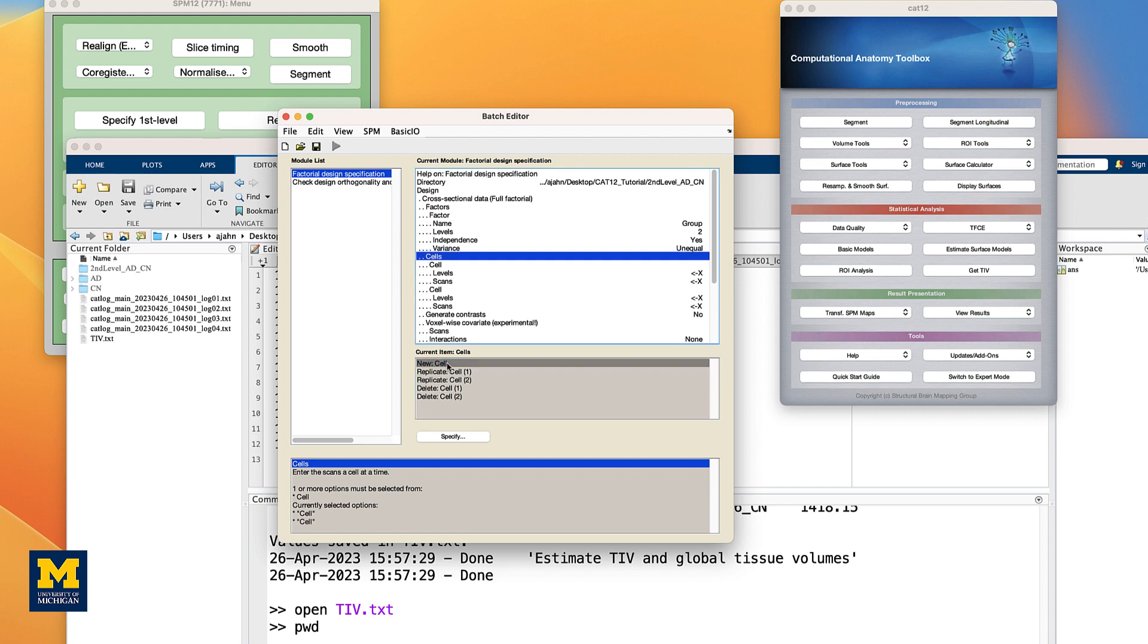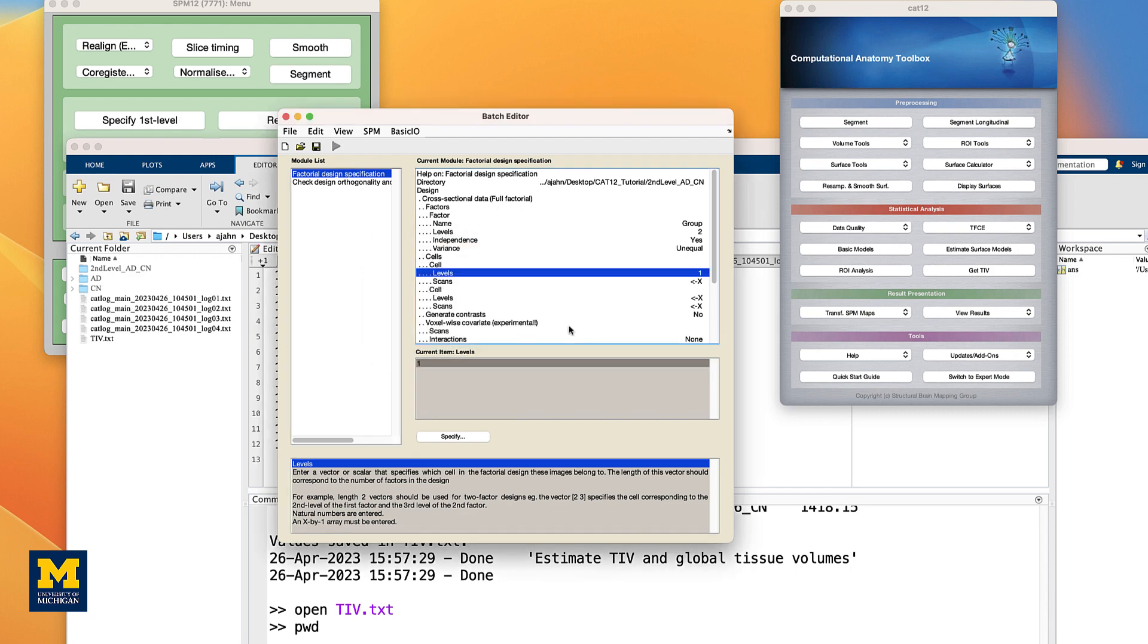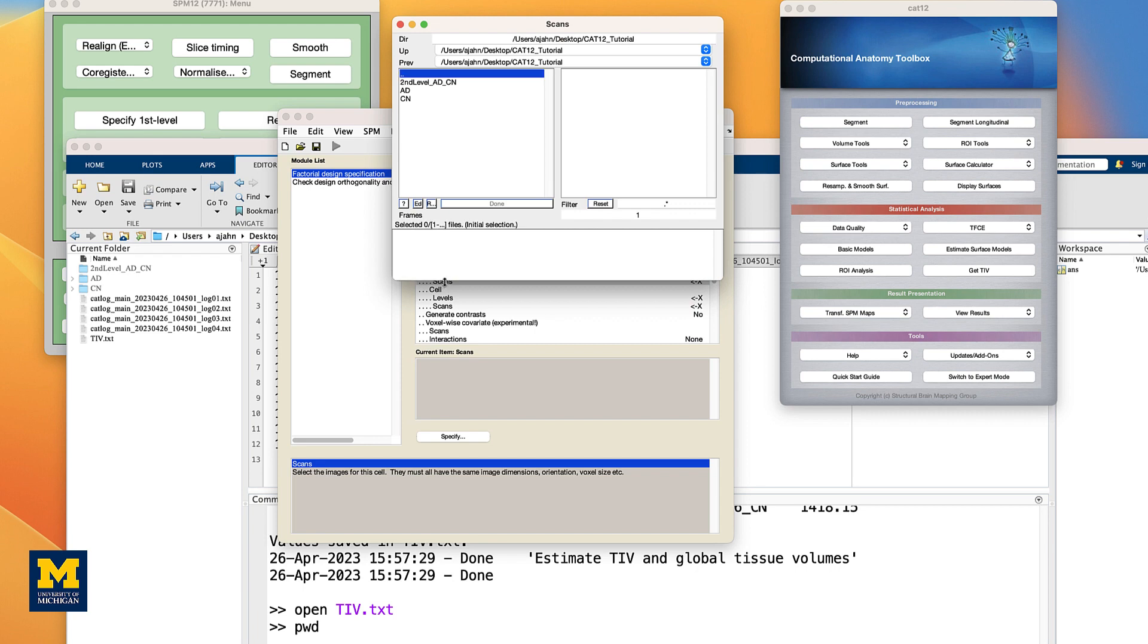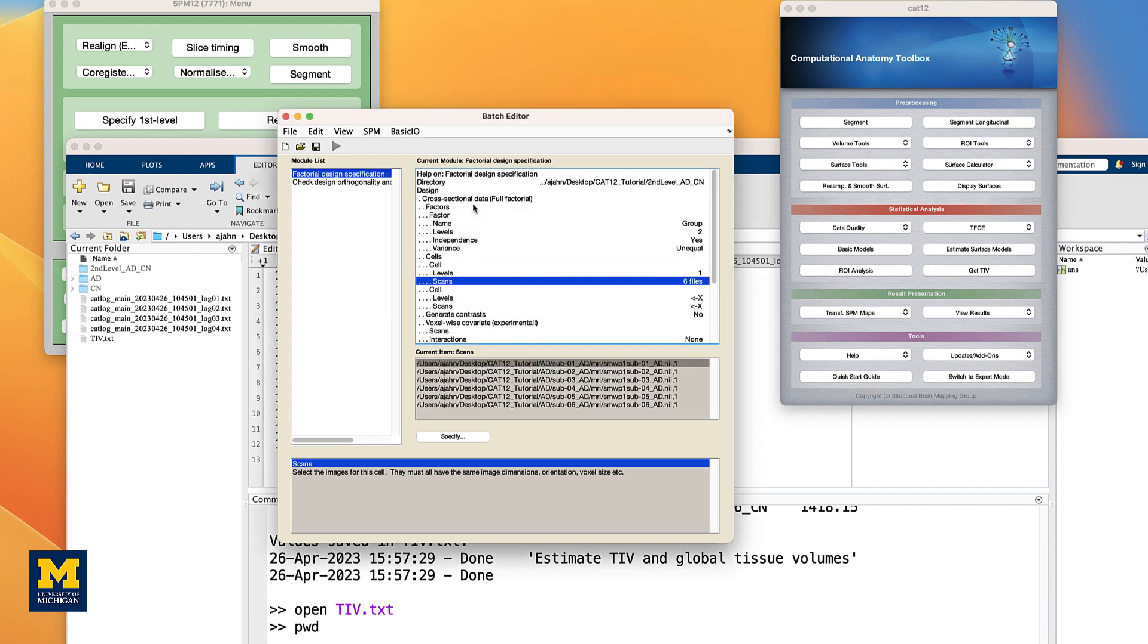Click on Cells, and then New Cell. For the first cell, click on Levels and enter 1. Double-click on Scans, navigate to the AD directory, and in the filter field, type SMWP1 to select the smooth gray matter maps for the AD subjects, and click the Rec button. Click Done.